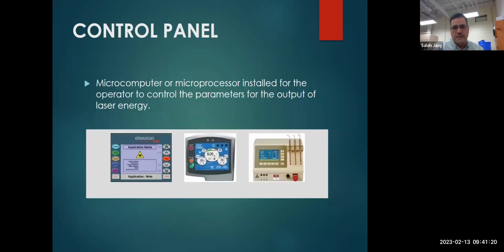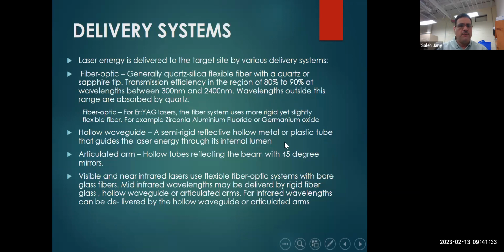And also this control panel. Control panel is very easy. It's self-explaining. You have the speed, we have the pulse, we have the energy, and we have the different handpieces. I forgot to tell you about different light. They have different light wavelengths.